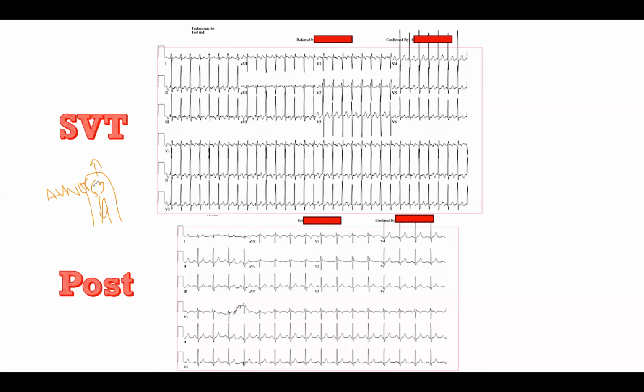So the general rule of thumb is that if you're in ORT, the time between the QRS and the next P wave, as Vlad said, should generally be more than 70 milliseconds. Now, my good friend and former colleague Scott Seresnak wrote a paper in which he discovered that you might have ORT in small children with an RP interval as short as 50 milliseconds.